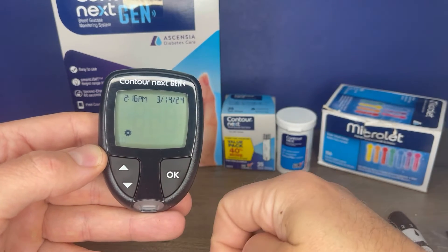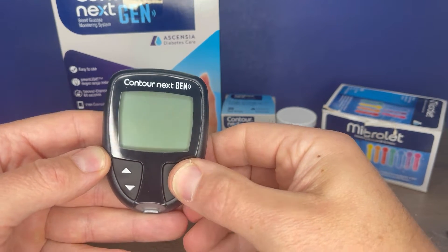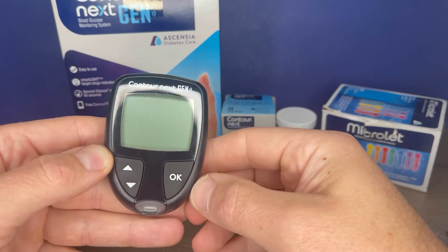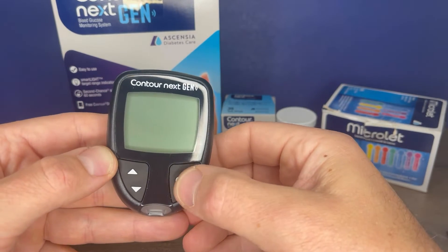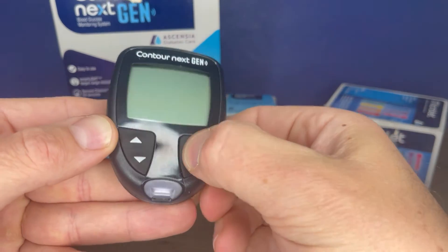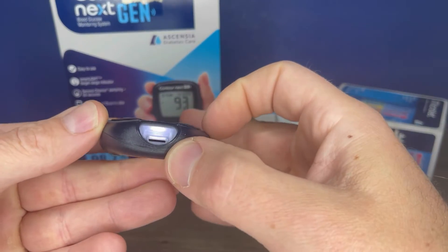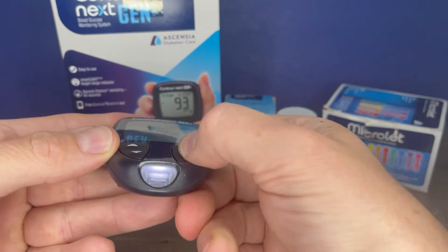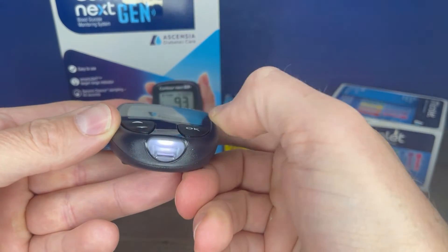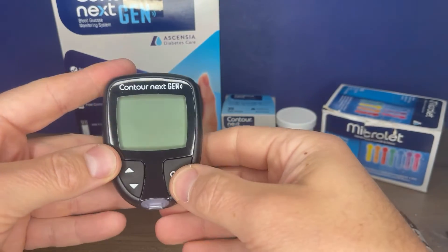To power off the meter, it will power off on its own after a few minutes, or you can hold the OK button and it will power off. Another option is to press the OK button twice — that turns on the test strip port light, which makes it easier to see in low light conditions.